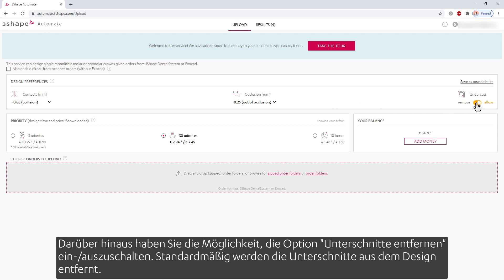Additionally, you have the possibility to turn on or off the Remove Undercuts option. By default, the undercuts are being removed from the design.